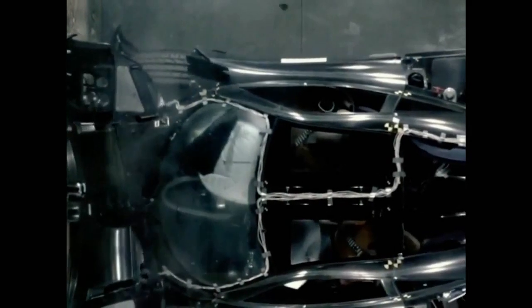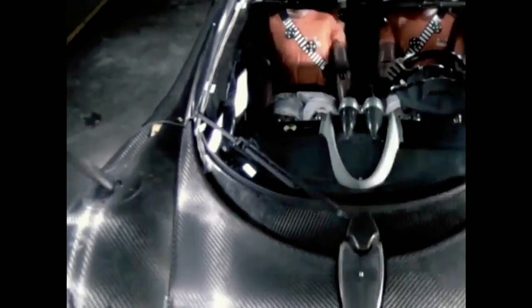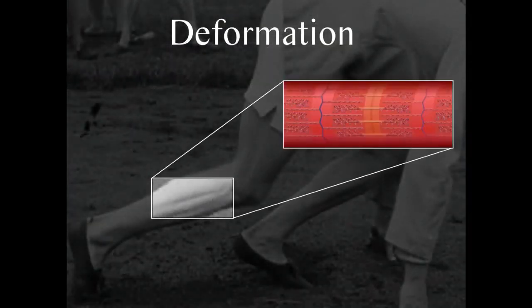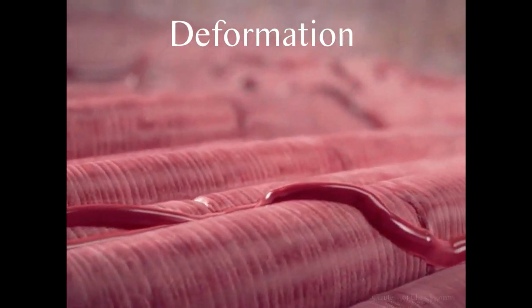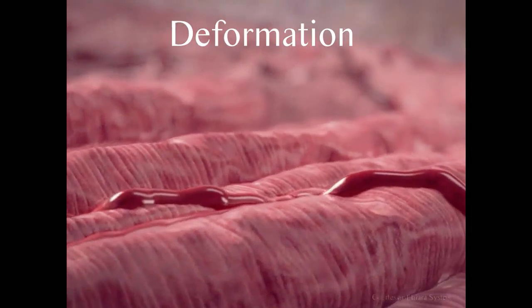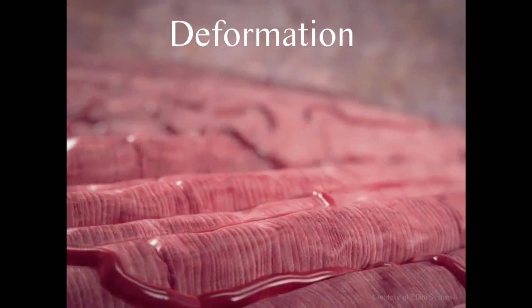And some types of deformation are permanent, like plastic deformation, much like this car, right? The car, as it strikes the wall, deforms, and it's unlikely to ever return to its original shape. The type of deformation that we're interested in, though, is elastic deformation. And it's happening continuously in our myocytes as we're going through contraction and relaxation. And obviously, it's not limited to skeletal muscle. We see this in cardiac muscle, where it started to give us this more detailed view of myocardial function. Specifically, detail that shows us whether supposedly normal, healthy myocardium can actually deform or shorten appropriately during contraction.